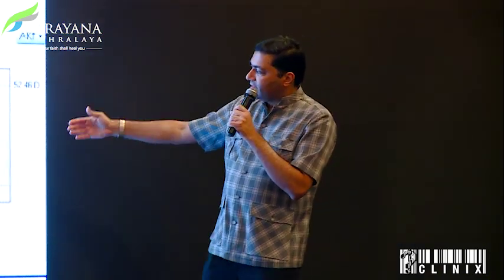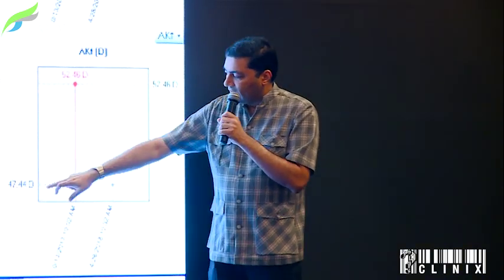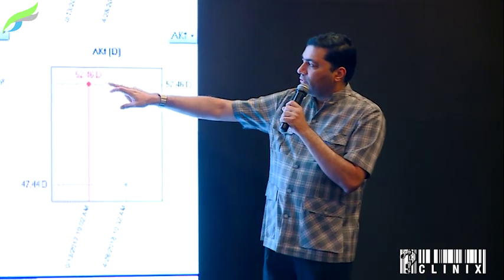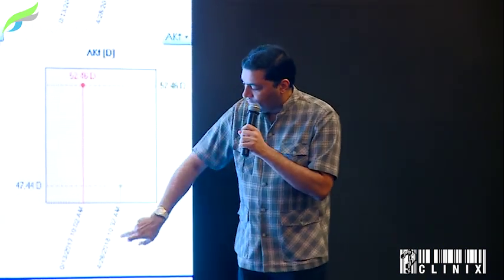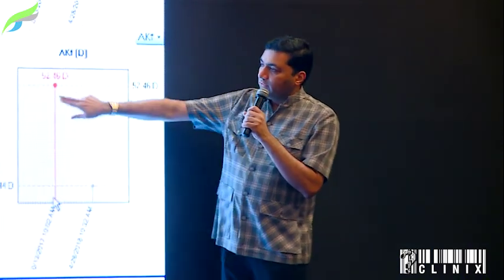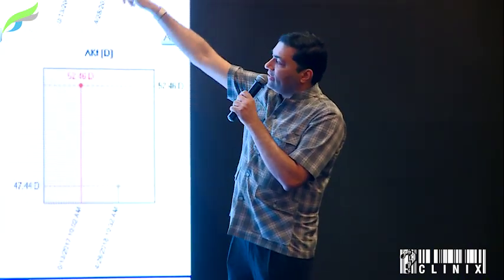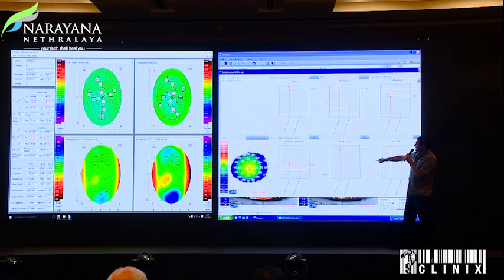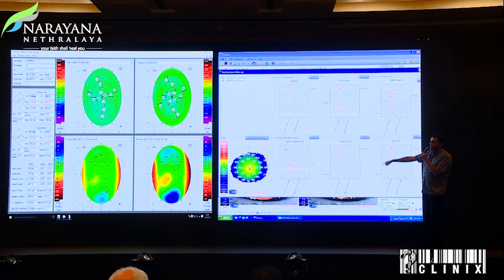This is a great map for looking at corrections you've performed. If this is changing — for example, this patient was at 47 and goes to 58 or the other way around — you can have the two time-point visits here. This tells you the amount of change: the BCV has changed, this is the root mean square for the front and the back. We've discussed Pentacam and we're going to discuss it now. But if you don't have it, there are enough tools out there. Just click the buttons — because it's not on your main screen doesn't mean it doesn't exist.